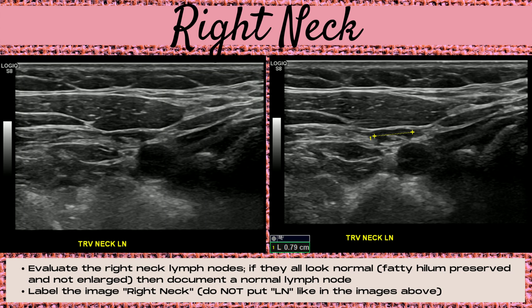Next, image the right neck. Evaluate all the lymph nodes on the right side of the neck. If they all look normal — meaning a thin hypoechoic outer cortex, a hyperechoic fatty central hilum, and not enlarged — then document one of the largest normal lymph nodes. Label this image 'right neck.' Do not put 'LN' (lymph node) like in the images above — this is a demonstration of what not to do.